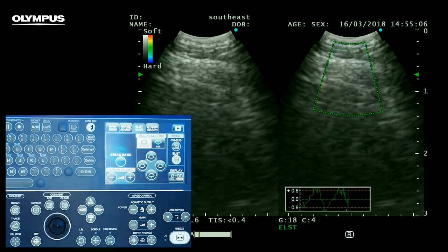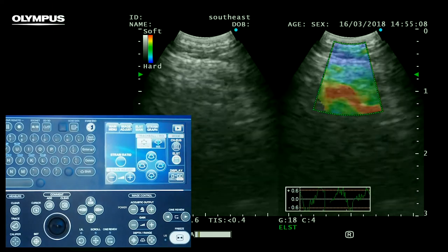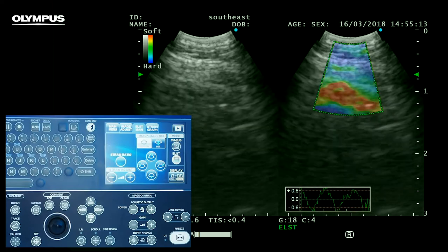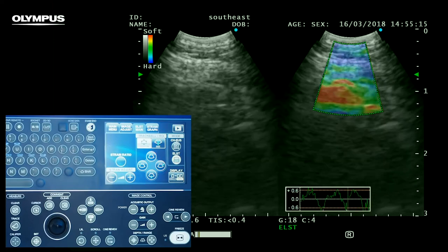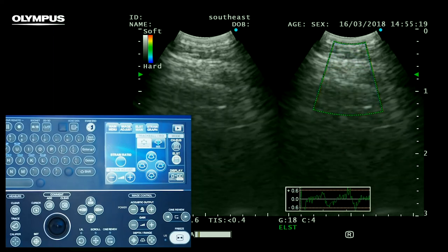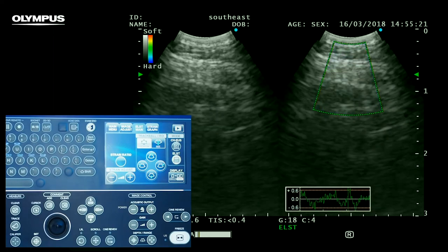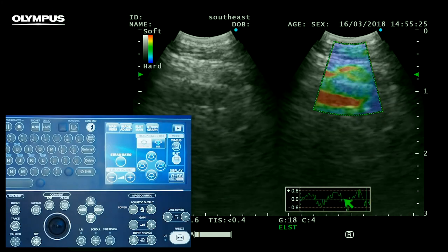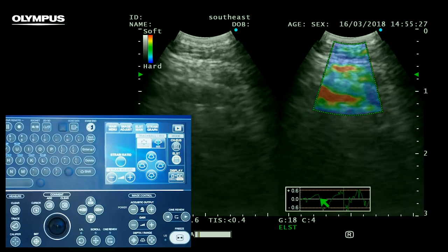Once we have set an appropriate ROI, we are ready to obtain our colour map. Normally, the compressions created from a nearby mediastinal vessel is quite adequate to create a clean map. The strain graph below represents the frequency and amplitude of our compressions. We'll come back to this in a moment.